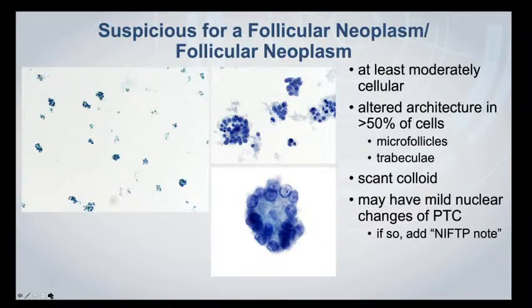We defined microfollicles as being aggregates of follicular cells that are crowded and show significant overlapping, not very good social distancing at all. There's typically scant colloid, and a subset of this category may have mild nuclear changes of papillary thyroid carcinoma, as shown in this case here.